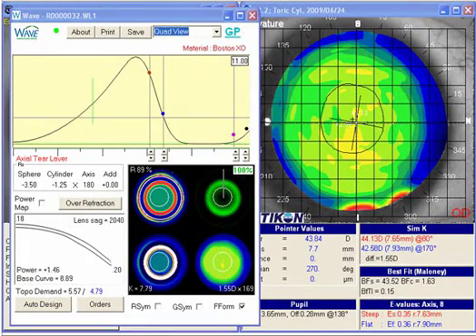And now we're going to go ahead and actually design an orthokeratology lens with an oval optic zone. So we're going to use this cornea as an example, and we'll note a few things here real quick. We have about a diopter and a half of with-the-rule cyl. Spectacle RX has -1.25 diopters cyl, axis 180. So that tells us that these line up fairly well. We should be fine here to create an oval optic zone.